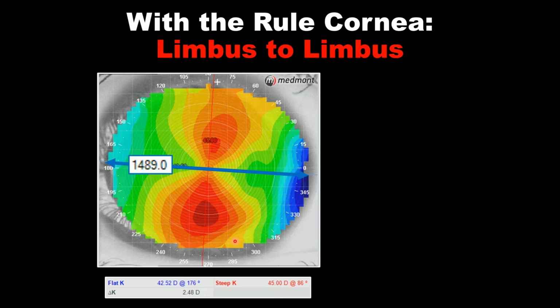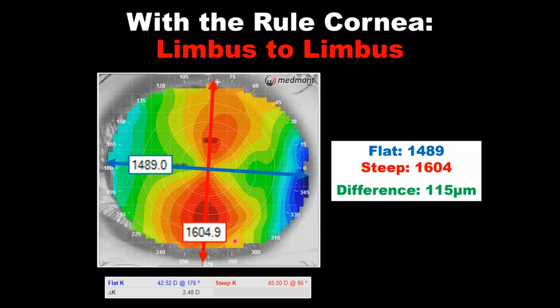Now, what if we were to measure the sagittal differential of this eye? Let's compare the flat, compare the steep. What's the difference between those two numbers?